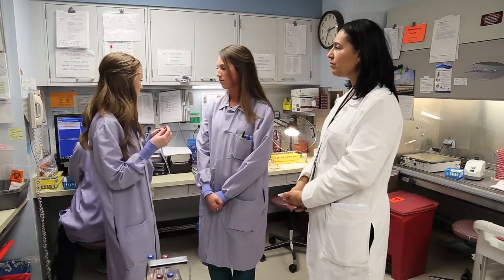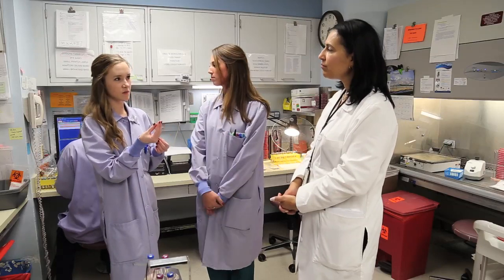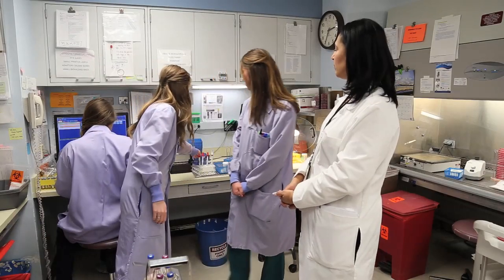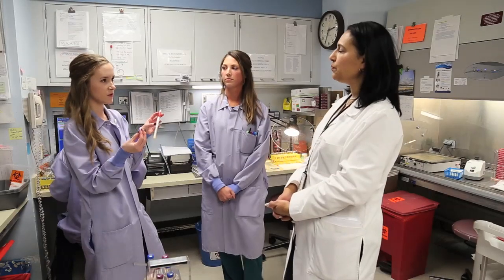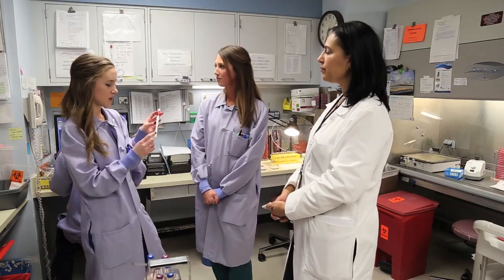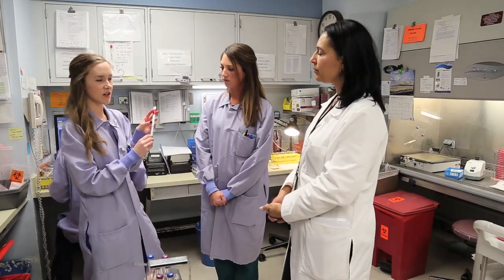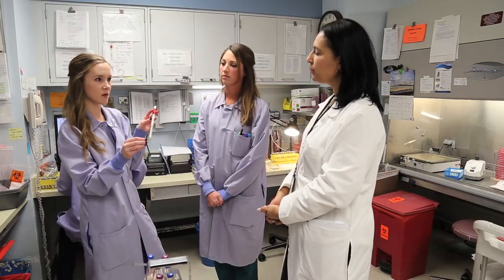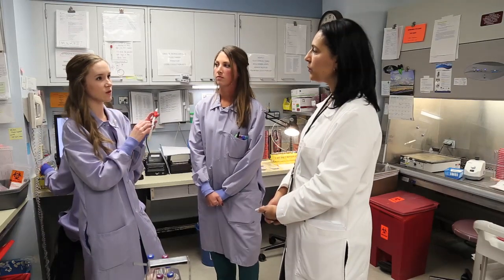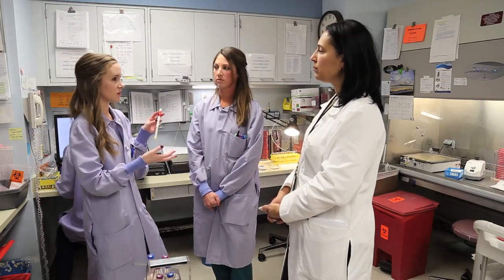If you have to put it on a swab, we don't have any here. The glass tubes are the tubes that you need for the aerobic and the anaerobic. If you just put it on a regular swab like this, and that's just the fluid, right? Just fluid. If you're using a swab for a fluid, if you have to, and you put it in one of these tubes, this is only going to get an aerobic culture. That's the only thing that it's going to sustain. So a lot of times we'll get these that have the aerobic and the anaerobic ordered on it, and we have to cancel it. We'll run the aerobic, but that's all we can do.